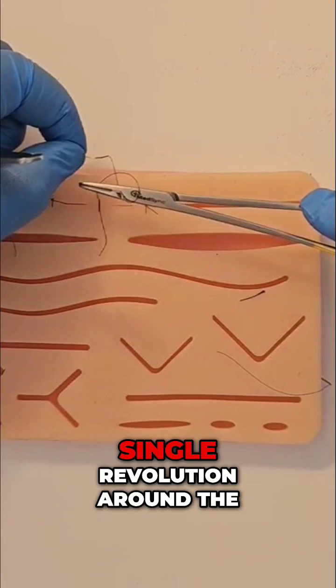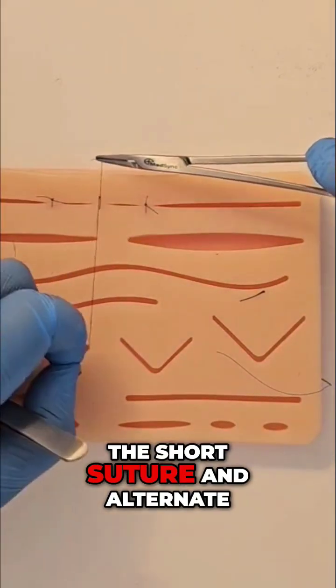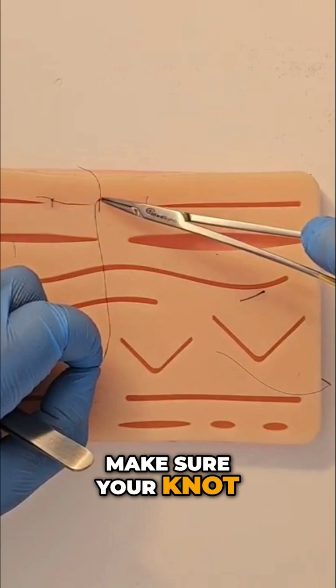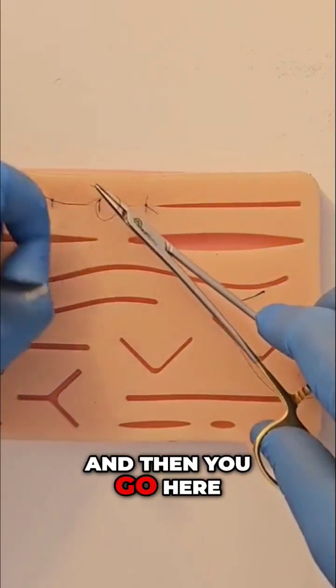The next step is a single revolution around the needle holder tip. Grab the tip of the short suture and alternate. Make sure your knot really does lay square and flat.